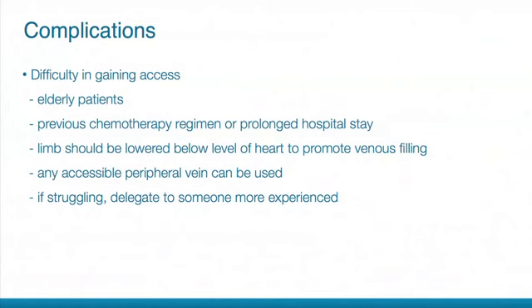If no flashbacks are seen, or if the cannula will not advance into the vein with little effort, withdraw the cannula and discard of it safely and apply gentle pressure over the puncture site if there is any bleeding.